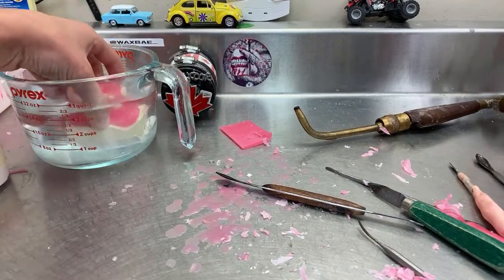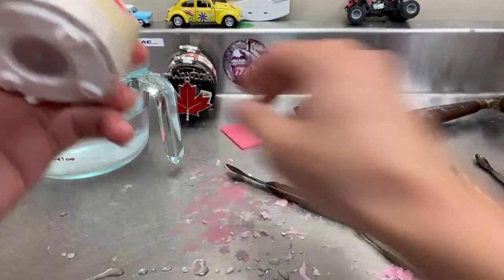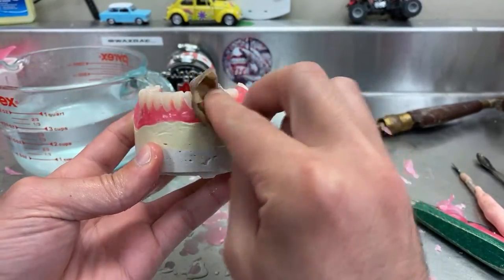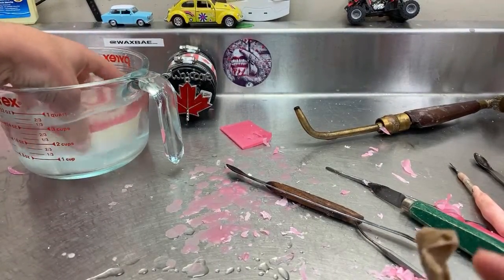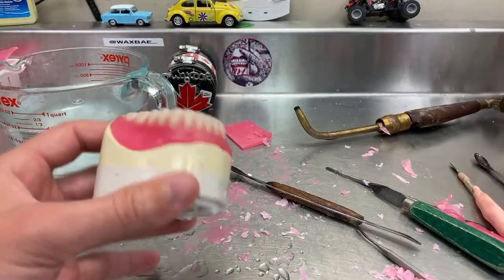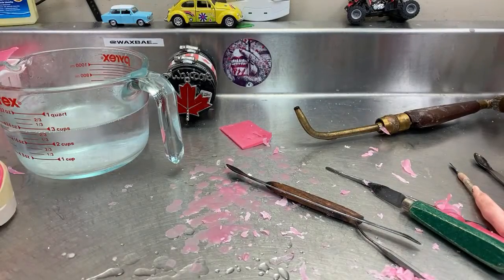Okay, so let's do that one since it's cold already, and I'll let that one cool down. And as I said, if your work is clean and nice and flamed well, your wax will look shiny before you even do it. Let me just dry it out with the air. That's way faster. And now the same thing for this one here.